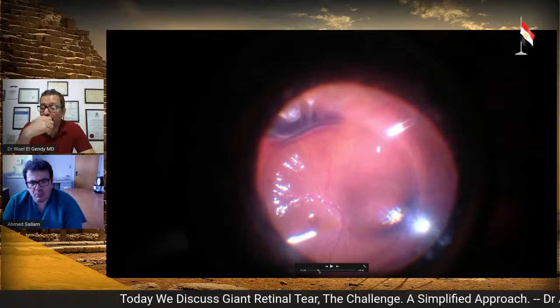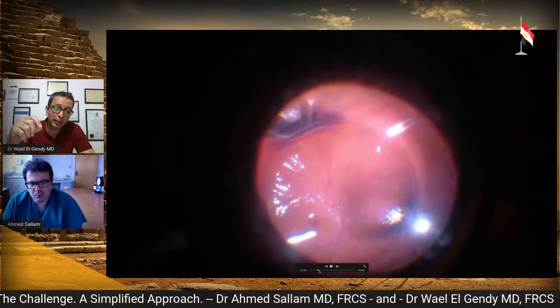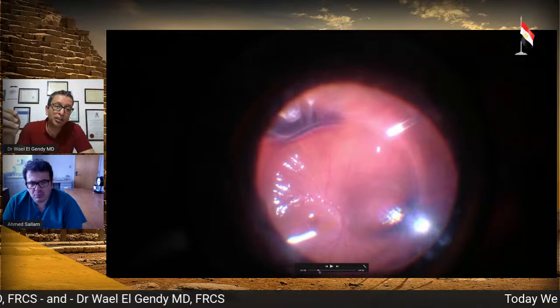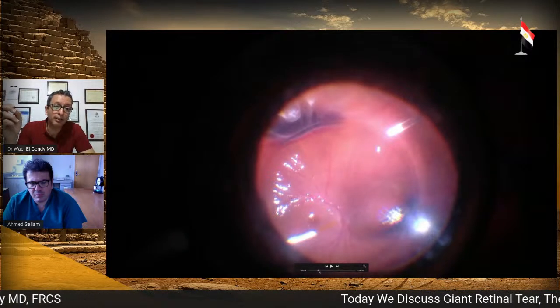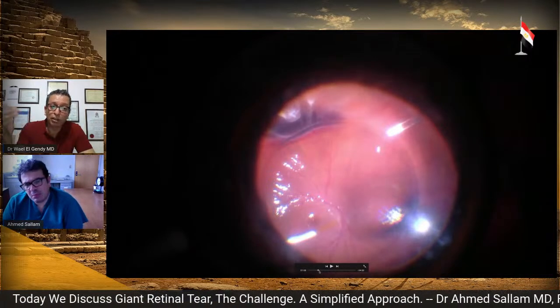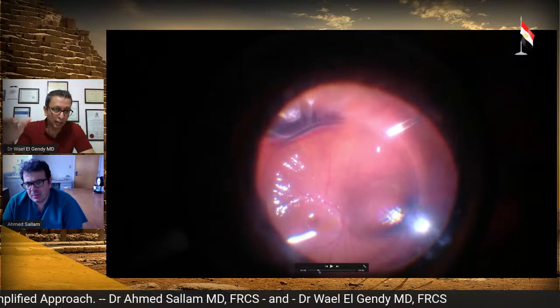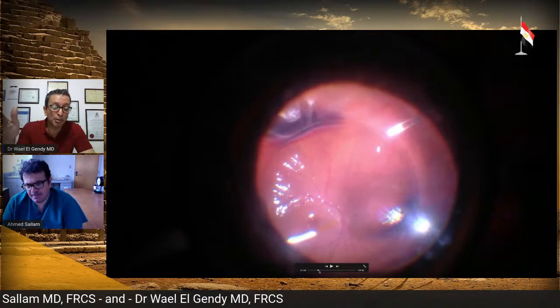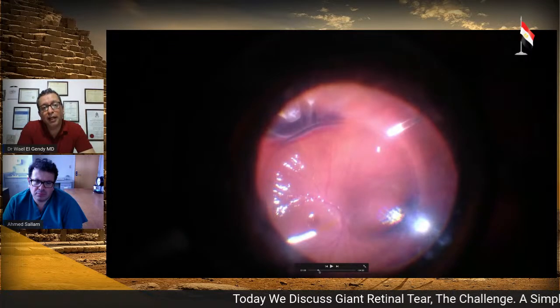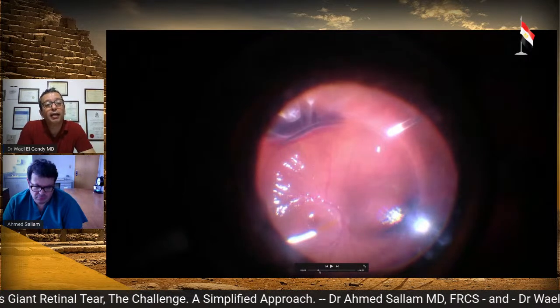So what I do is I detach the irrigation line and let the fluid come out gently from the irrigation line as I inject the PFC. Because if I don't do that, that's true. I can see the pressure going very high, and I can see the disc going pale, and the artery stops pulsating after a while. Yeah. So this is a nice trick for people who don't have access to an expensive tool like that.